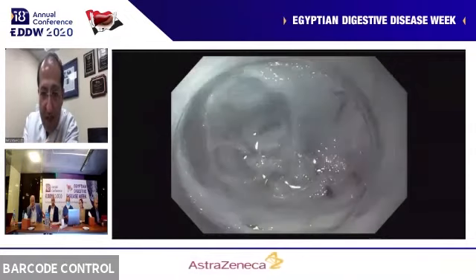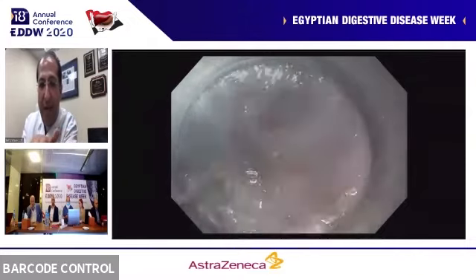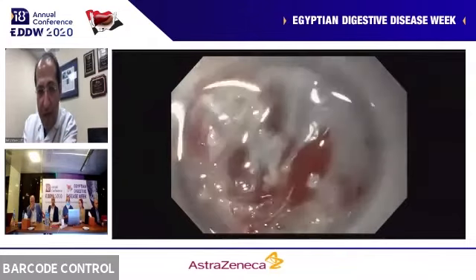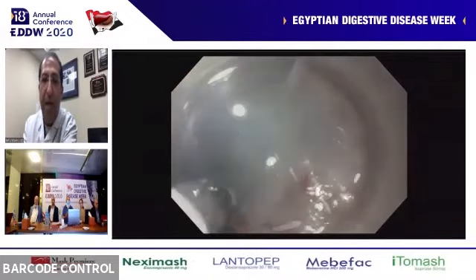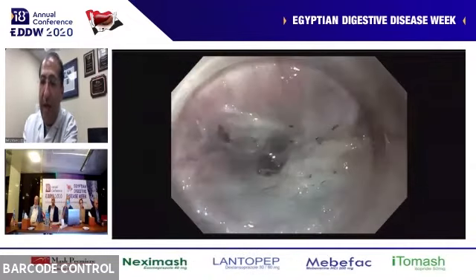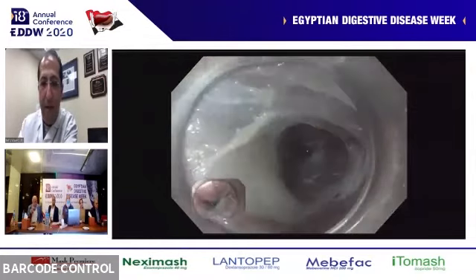You can see muscle. It's very sticky to the surface of the mucosa. And I'm seeing that from underneath a lot of adhesions, a lot of fibrosis from the chronicity. I inject excessively. And then I will pause here for just a second.